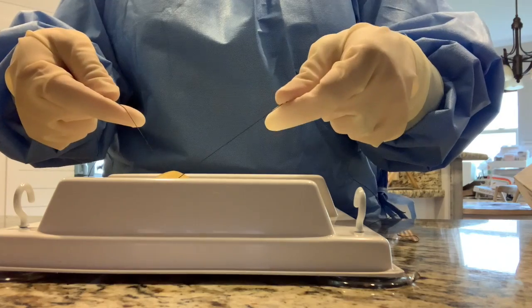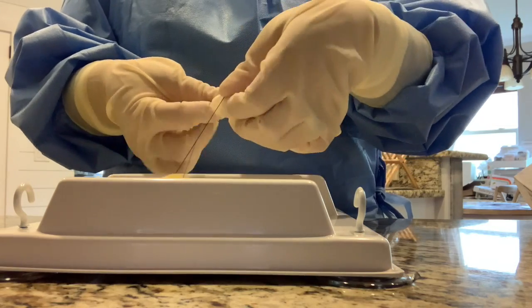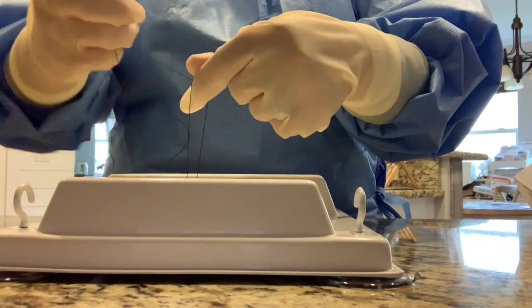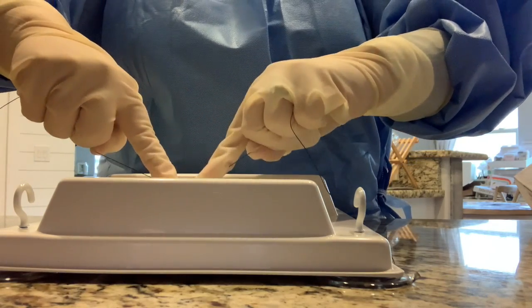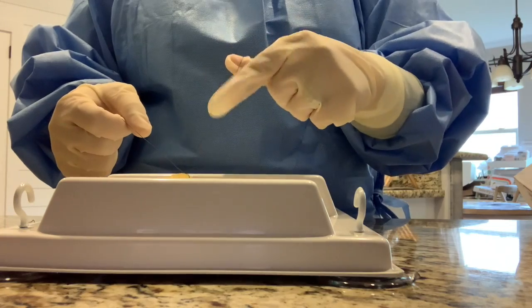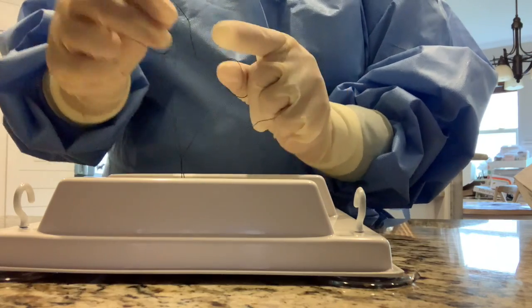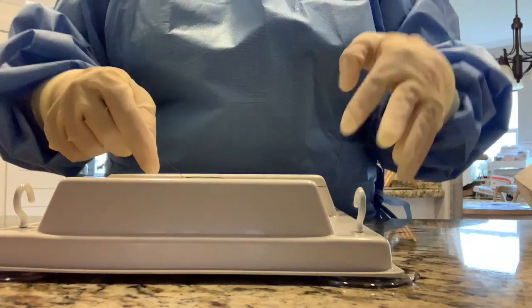We're going to do a two-handed knot. What you do is make sure that you cross them first. With your index finger and your thumb, you grab a hold of the other side of the suture and pull it through once. Now your hands will be crossed as you place it down. Then from here, you loop it with your thumb, bring the other one across to create a loop, grasp the other suture with your index finger and thumb, and bring it through the loop. As you go down, you cross.